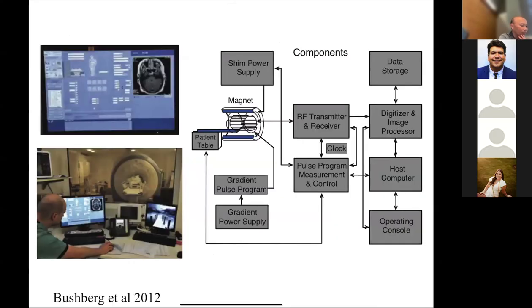The last thing with an MRI system is that what you typically see as a patient is the MRI, the bore. There's a lot of electronics on the side, especially with new designs, and a whole lot of other things like computers, amplifiers and power supplies in the equipment room. You'll have wires running up through the ceiling and down into another room.